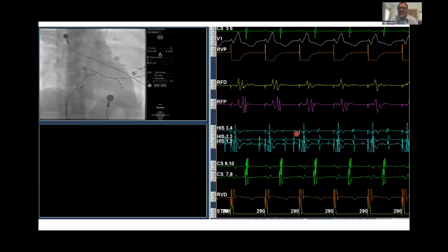Sometimes we are able to see a very sharp deflection between the atrial and ventricular EGM. And if we can see a sharp deflection, that may point to where the pathway is. And a lot of times we may see a potential in a particular area. The ventricular EGM may not be the earliest there, but ablating there surely gets rid of the pathway.